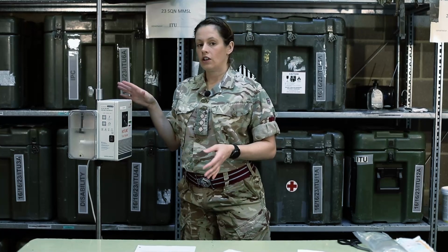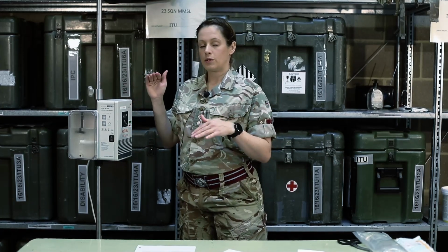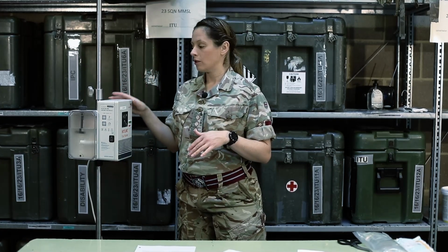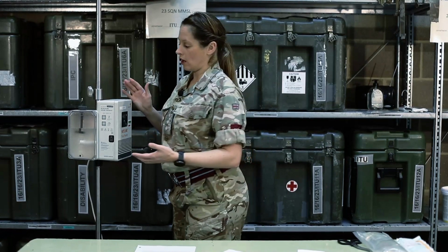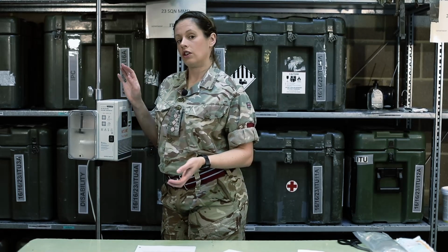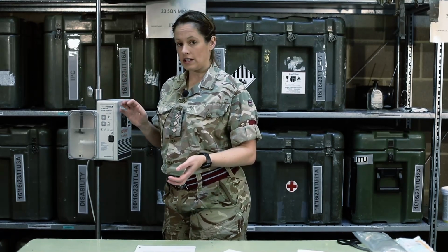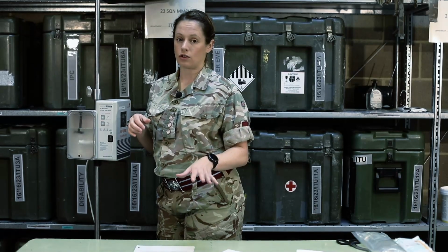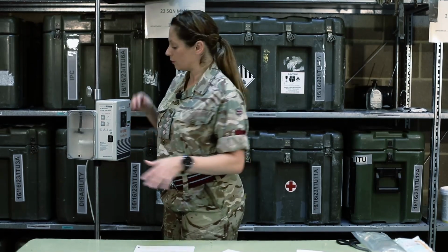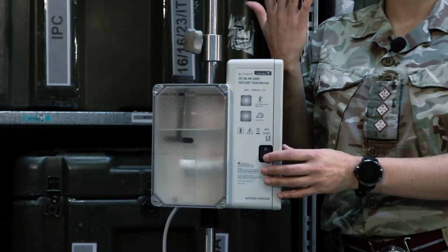So now that we've filled the Hotline fluid warmer in between the minimum and maximum lines with distilled water, and we've done our checks, we're now going to turn it on. Like I've discussed, the water should be changed every 30 days and also the O-ring should be lubricated every 30 days with a grease that you can order from the manual. So I'm just going to turn it on the side and you'll hear an audible alarm.